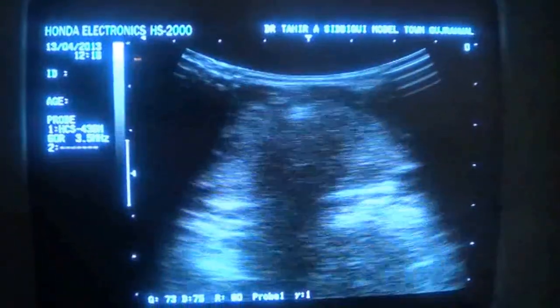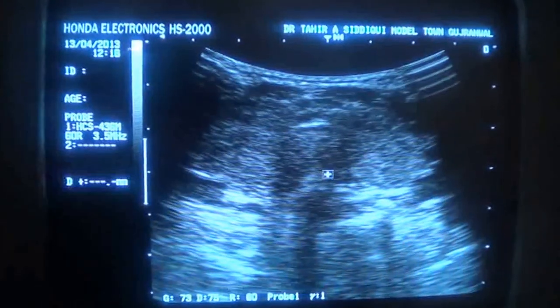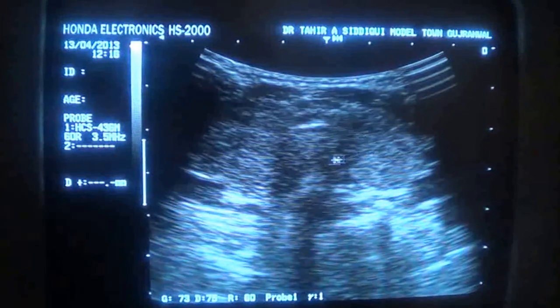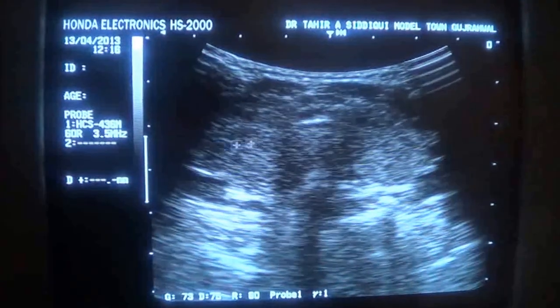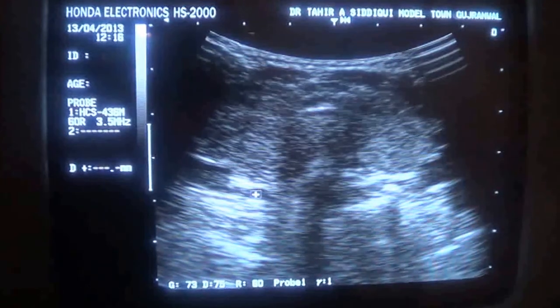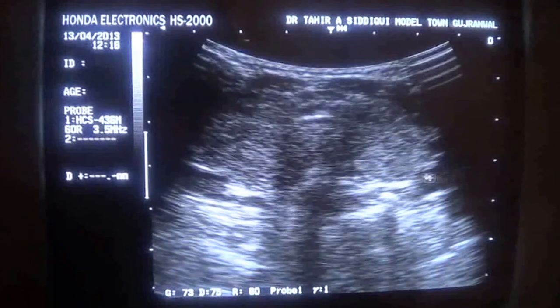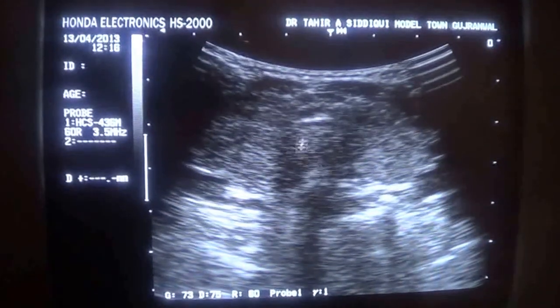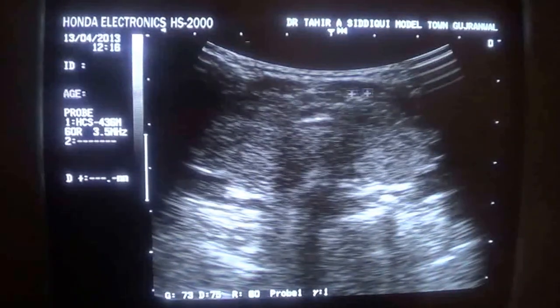These are the two thyroid lobes. This is the left lobe of the thyroid in transverse section. This is the right lobe of the thyroid in transverse section. The common landmarks being the common carotid artery and internal jugular vein. This is the trachea and this is the esophagus.